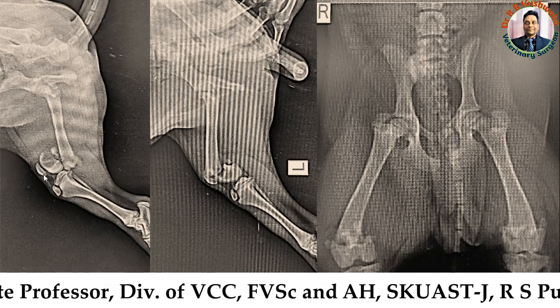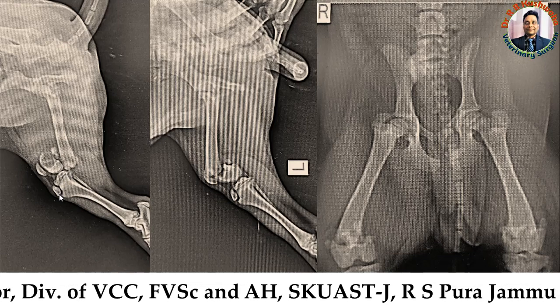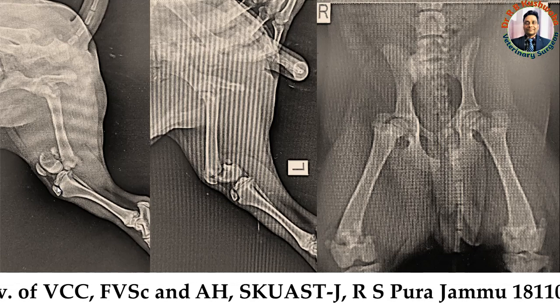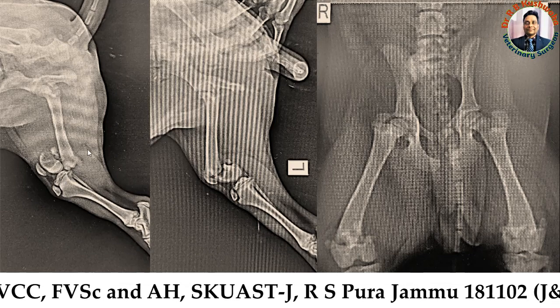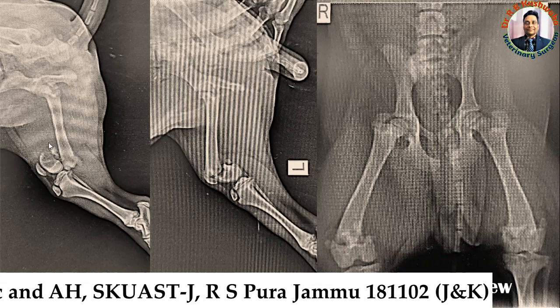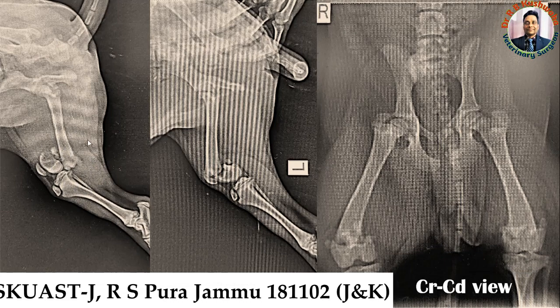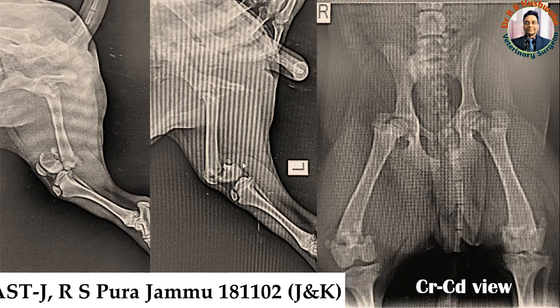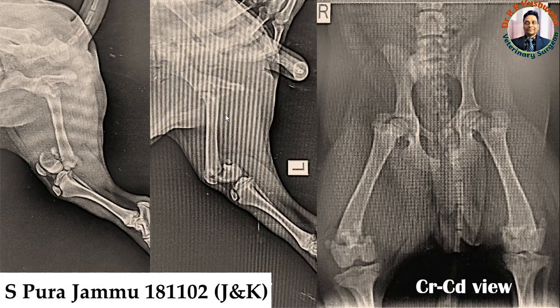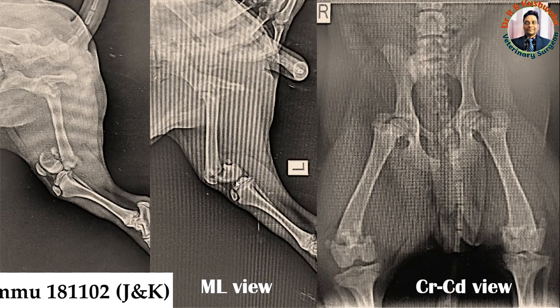You can see the patella, the two femoral condyles, the tibia, and the apophysis of the tibia. The apophysis is intact here, which confirms this is the radiograph of a young dog. As mentioned in the history, this is a four-month-old Spitz dog. If you see the medial-lateral view of the left femur bone — contrary to the right femur bone — the condyle is deviated caudally.